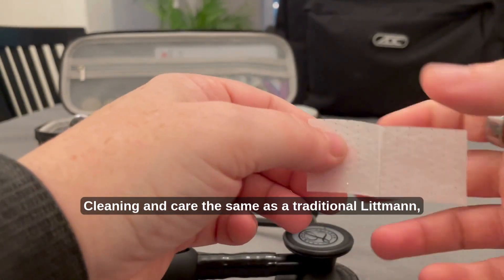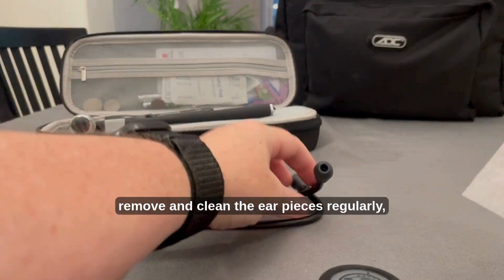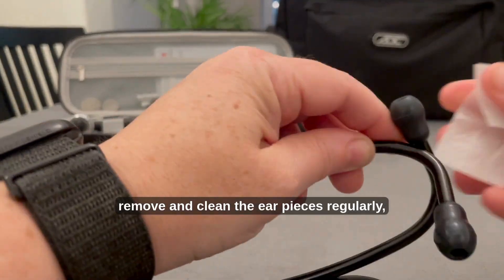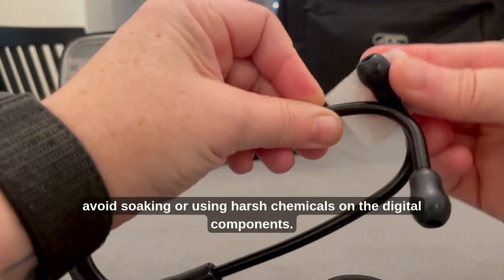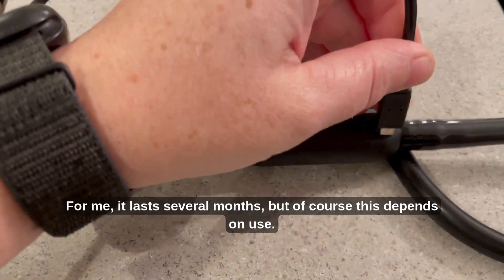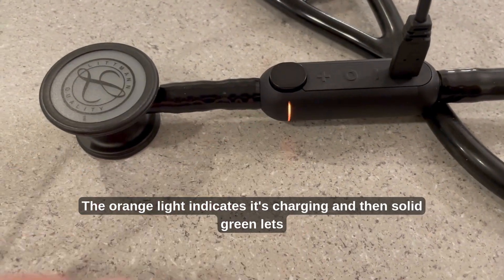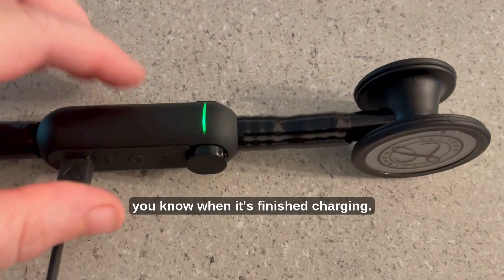Cleaning and care are the same as a traditional Littmann. Wipe the tubing and chest piece with alcohol after each use, remove and clean the earpieces regularly, and avoid soaking or using harsh chemicals on the digital components. It doesn't take long to charge — for me it lasts several months, but of course this depends on use. The orange light indicates it's charging, and solid green lets you know when it's finished.